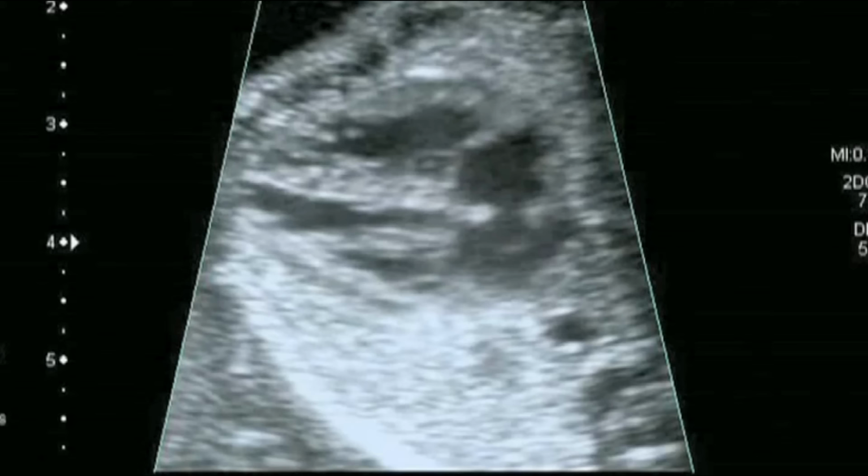Just to illustrate again the same points: the right and left ventricles, the right and left atria, the interventricular septum, the atrioventricular septum that arises as a result of the tricuspid valve and the mitral valve having offset positions. This is the base of the interatrial septum here, and the moderator band, which often can be seen filling the base of the right ventricle.